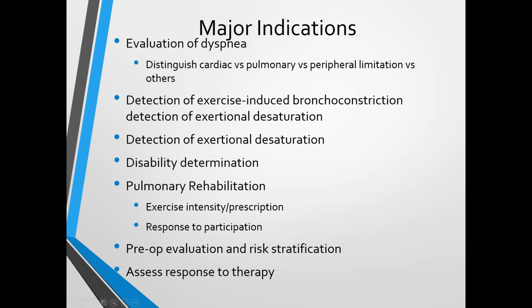Now, I will tell you that it's less common to do cardiopulmonary exercise stress testing prior to every time an individual goes for pulmonary rehabilitation, okay? But it is pretty much standard to do some form of pre-screening, and it may be the 6-minute walk test, okay, to determine before pulmonary rehab, they were able to do this. Afterwards, they've increased their functionality in some demonstrable, measurable fashion. And again, at the end of this presentation, I'll talk briefly about the 6-minute walk test.